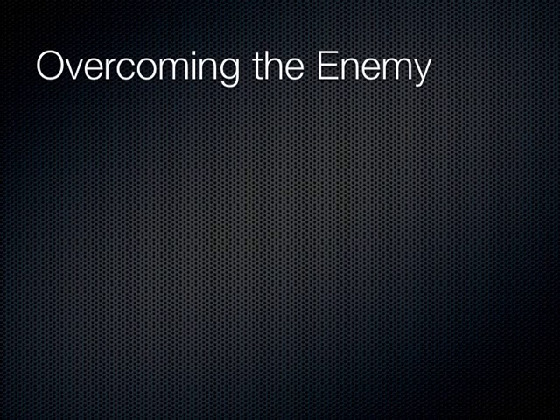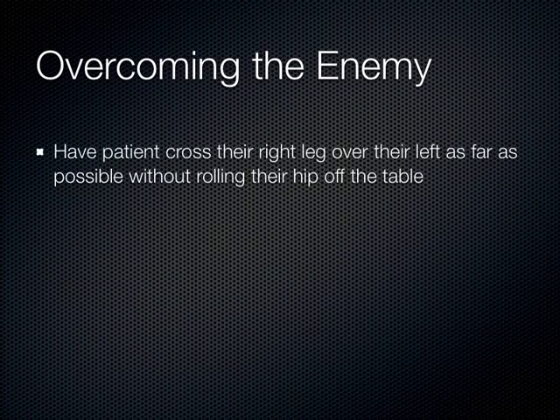So how do we overcome that enemy of bowel gas? Well, the first thing I do is I have the patient cross their right leg over their left leg, and we'll do this today with the models.